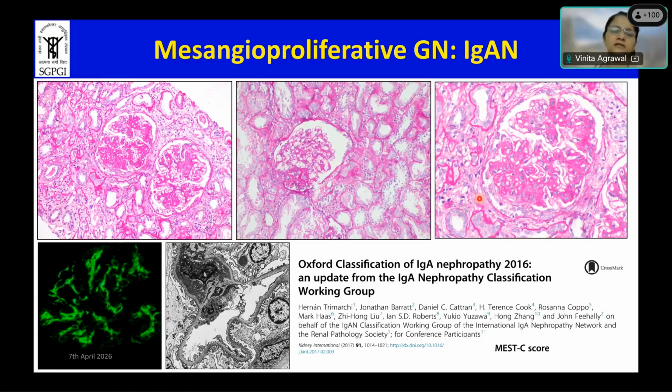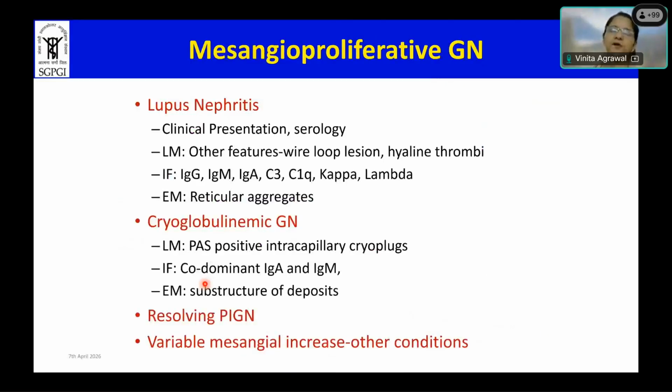Okay. So this was an IgA nephropathy. Apart from IgA nephropathy, as I said, this is just a pattern of disease, mesangial-proliferative glomerulonephritis. If you find IgA, you will say IgA nephropathy. In this patient, there was rash also, so you can say IgA vasculitis. But generally, those patients also have crescents. Generally, HSP or vasculitis has crescents also. But fine, it is IgA vasculitis. But if you have a mesangial-proliferative pattern of injury, you also need to consider other diagnoses and make your definite diagnosis on the features that you are seeing.